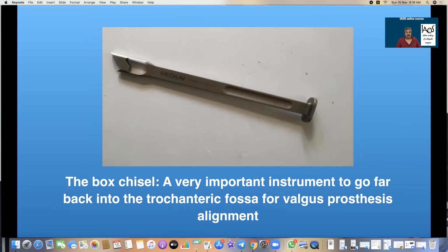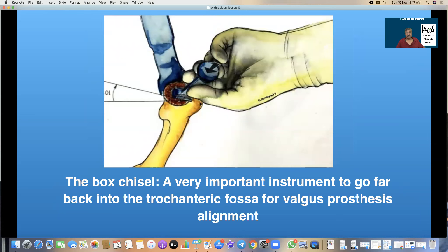A very, very important instrument is the box chisel. This is the starter and accurate use of this is essential to ensure that you have correct valgus seating. The tip here goes as far back into the trochanteric fossa as possible to ensure that we start at the correct point. This is 10 to 12 degrees of anterior rotation from the lesser trochanter, as far back into the trochanteric fossa as possible — that is the most correct orientation for entry of the prosthesis.